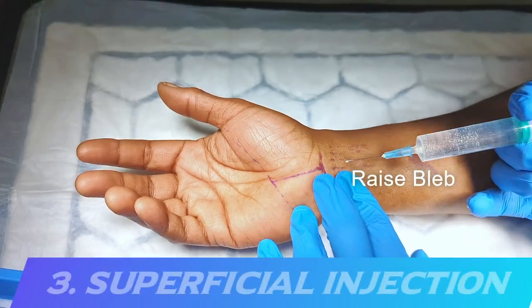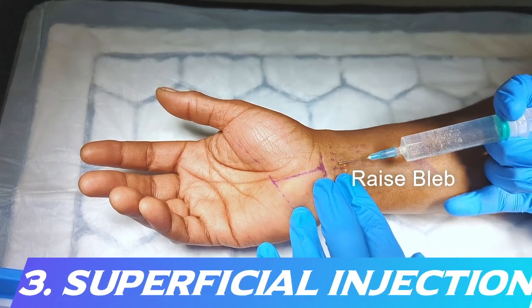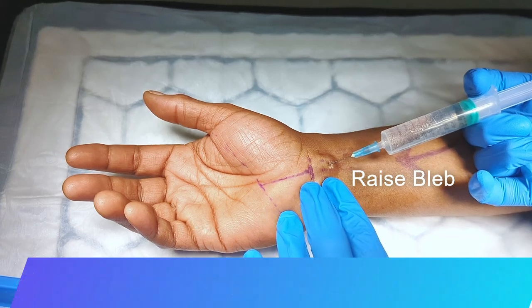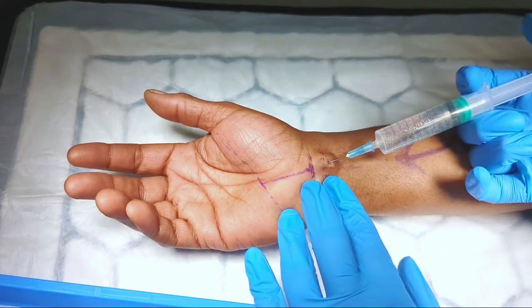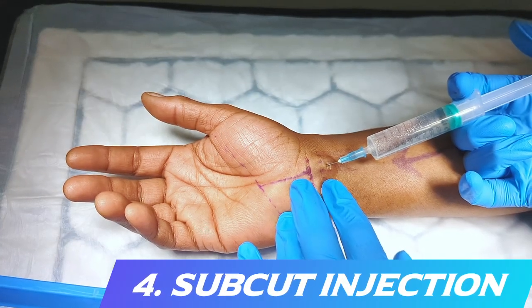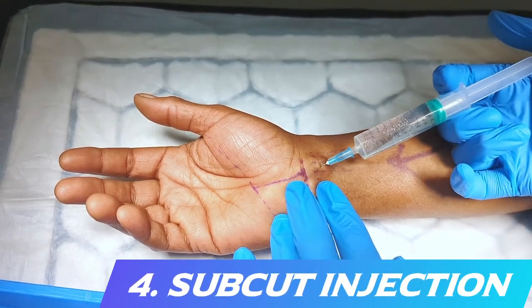A very superficial bleb of local anaesthetic is injected initially. After giving this a few seconds to work, local anaesthetic is then injected subcutaneously from the area already anaesthetised, advancing along the incision line.